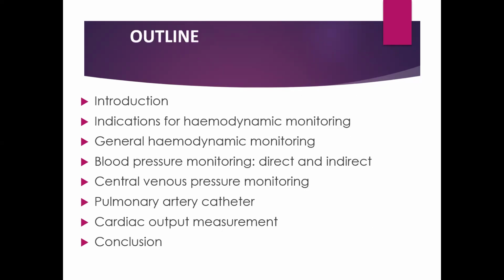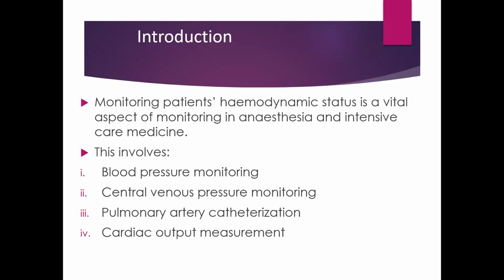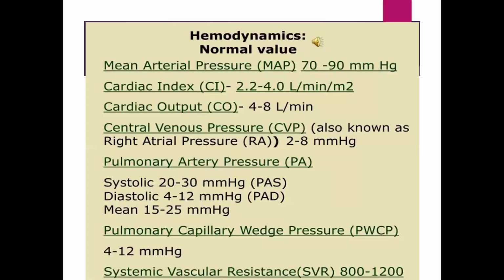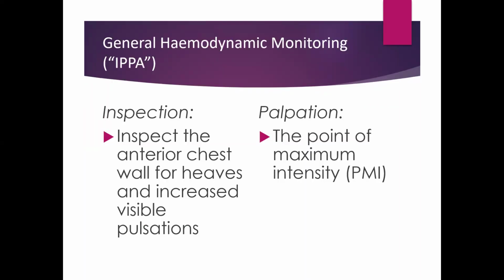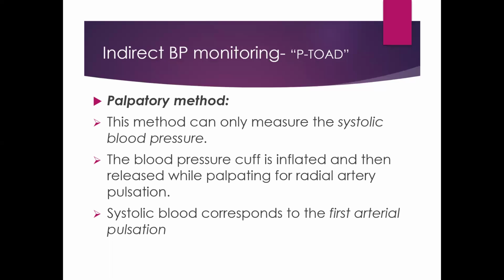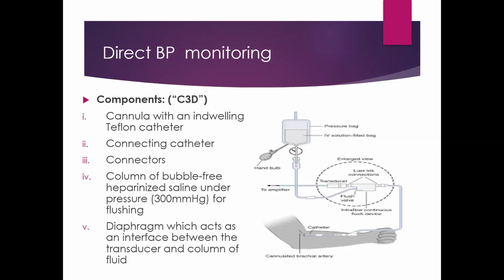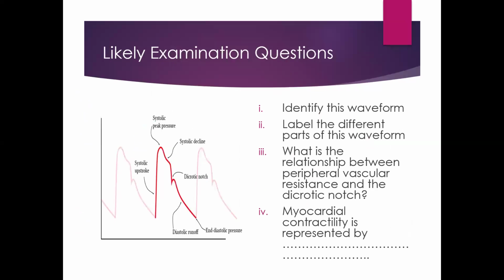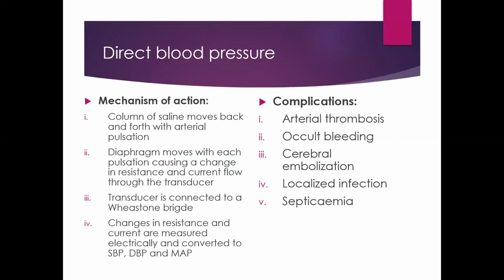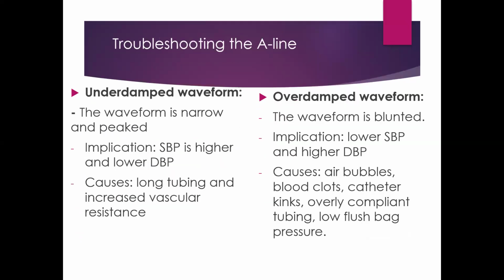So we looked at arterial blood pressure monitoring last time. We looked at general monitoring. We looked at the non-invasive or indirect blood pressure monitoring, and we looked at direct blood pressure monitoring. Where we had some interesting discussion was on damping, the arterial waveform and damping.